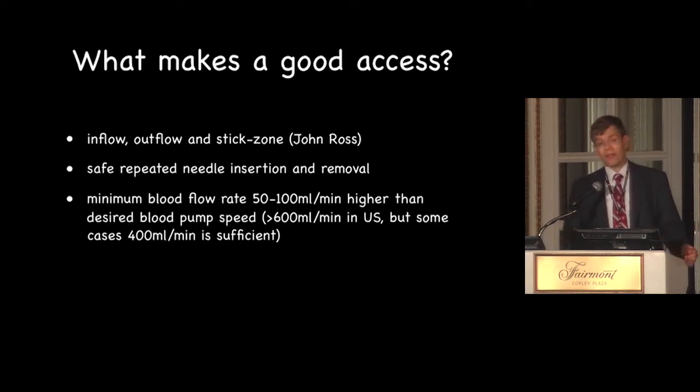You want to have a blood flow rate that is 50 to 100 ml above the desired blood pump speed. And we're all pressured for short treatments, but sometimes if your access only delivers 400 ml per minute, you may have to say, well, dialyze 4 or 5 hours, but you get good clearance.